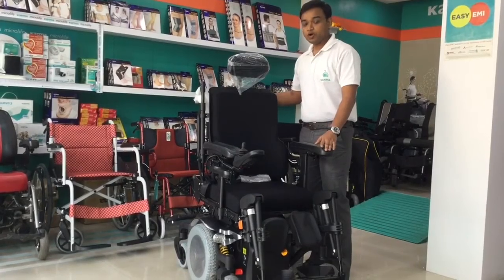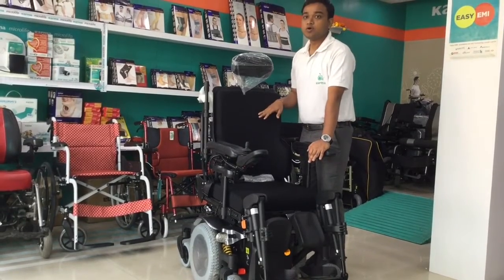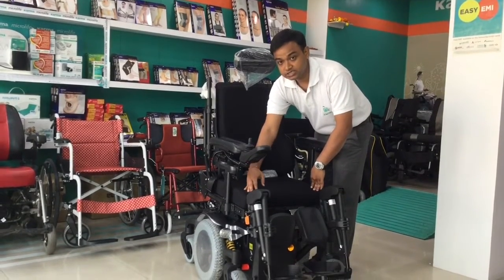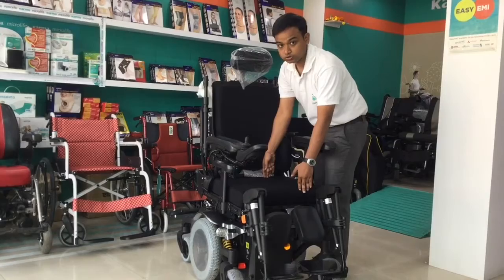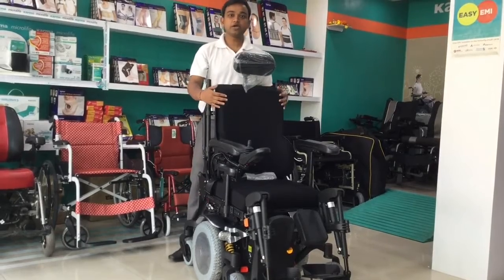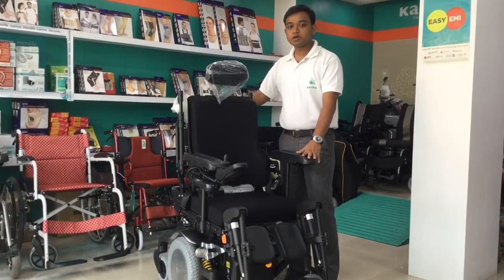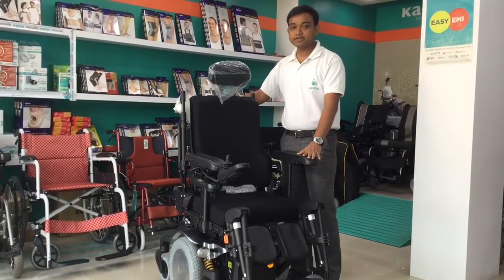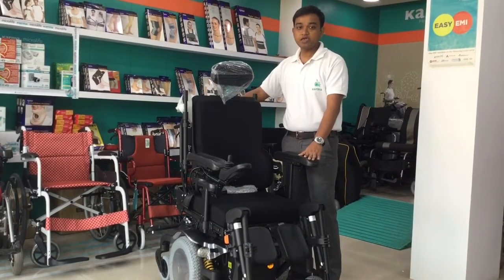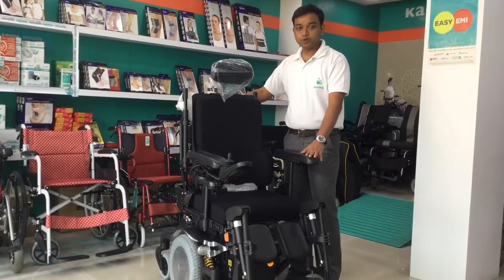The seat width can be adjusted from 16 to 20 inches. Not only the seat width — the backrest height can also be adjusted as per the user's needs. This is the Karma Morgan Kicks, the Karma Integrated Seating System. It has the advanced features you may imagine. The Morgan Kicks can be used for indoor as well as outdoor purposes.